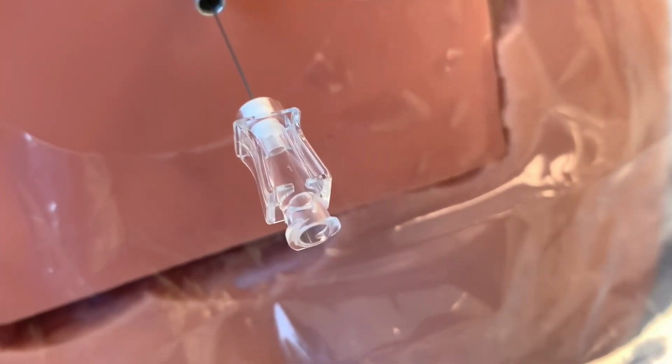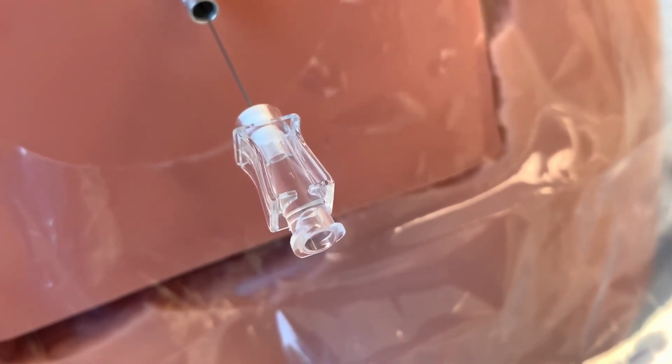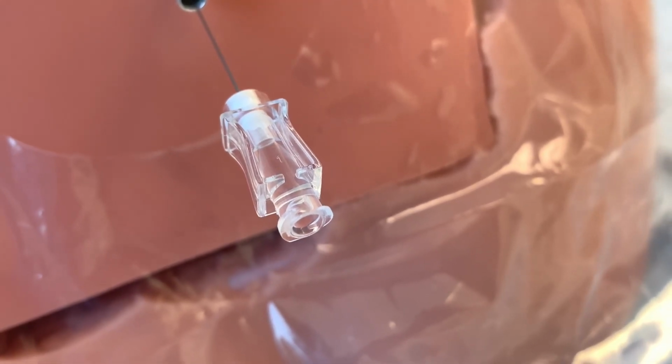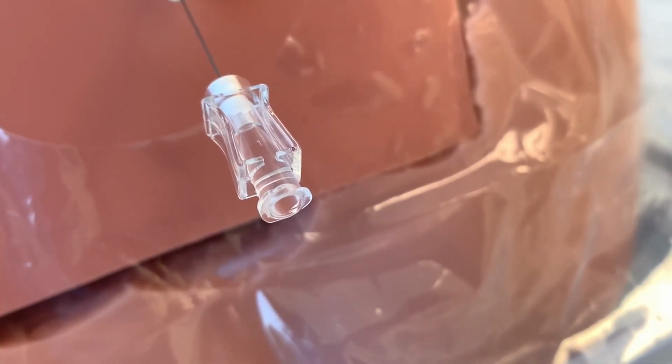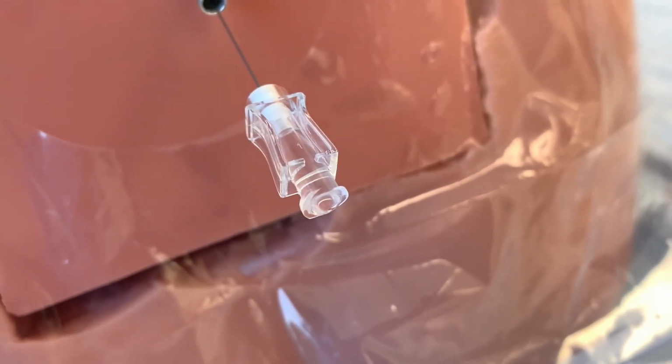So you'll notice it's a very, very slow creep out. It's not going to run out. It's a very slow creep. And it's at this point that you could connect to this, and you could actually administer whatever medication that you were needing to give. And you just hook directly up into it. And in a real patient, again, you wouldn't let it flow like this.